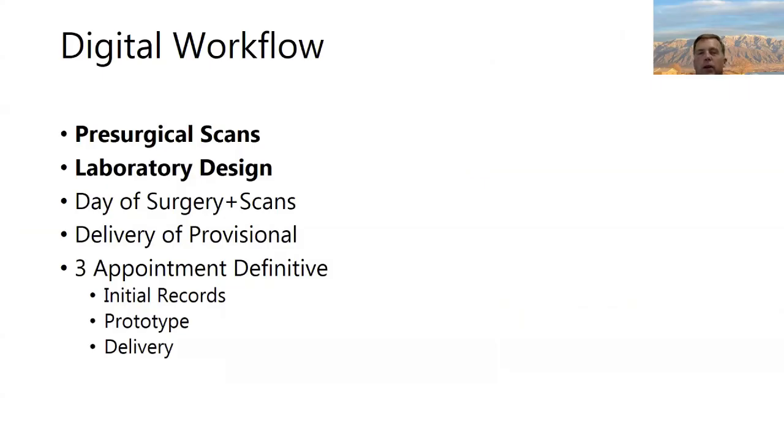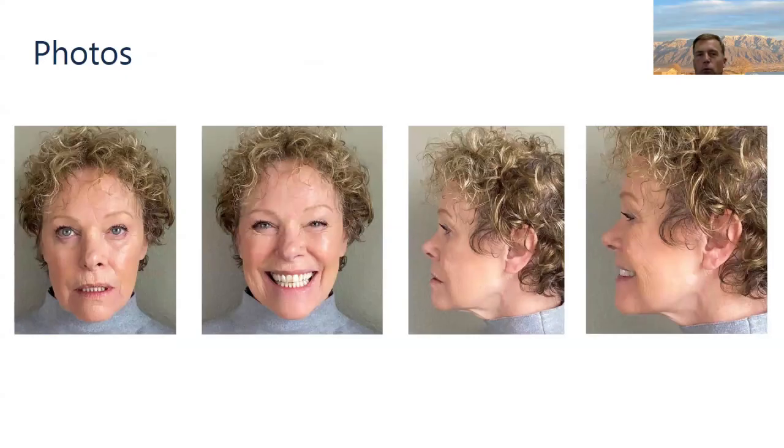So if you don't want to do that, let's talk about the digital workflow. Here's that slide I warned you about. So this is now what we're going to be following. We've kind of finished the theory part, and we're going to start talking through how you do this digital workflow. So the first appointment, you're going to take your pre-surgical scans or your pre-surgical records.